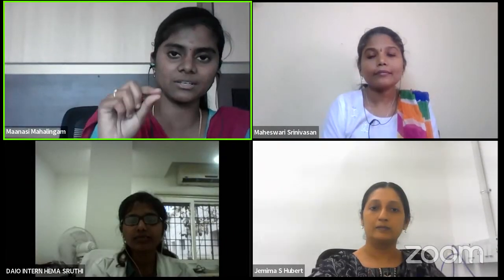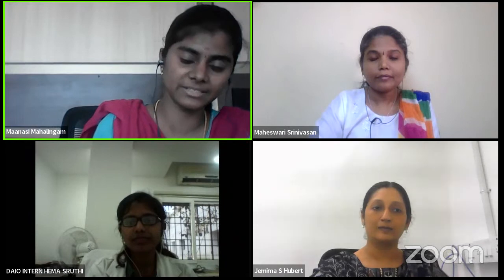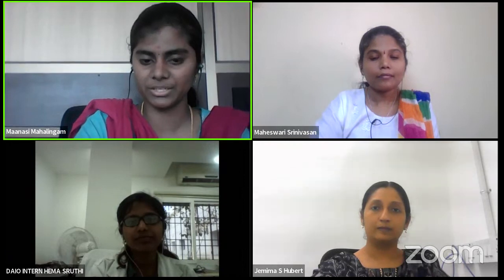When will the foveal thickness be increased? I think we have discussed just now. And when will the subfoveal choroidal thickness be thinned or increased? Any idea? Others? Are there any answers from YouTube? Yes, ma'am. For foveal thickness high, they have said edemas. Any edema in the retina will cause foveal thickness to increase. Okay.